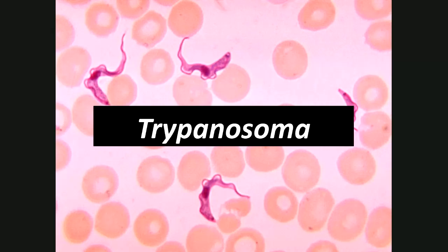Everyone, in these slides we are going to be taking a look at Trypanosoma. Trypanosoma is a rather interesting organism, and you can see it right away in this picture. I'll just point out a couple of them for you. So you can see this dark pink or purple wavy curl. Okay, we have a couple of them in this picture.